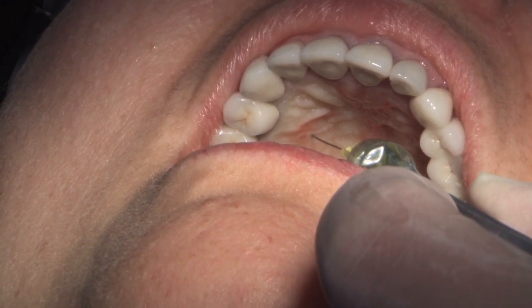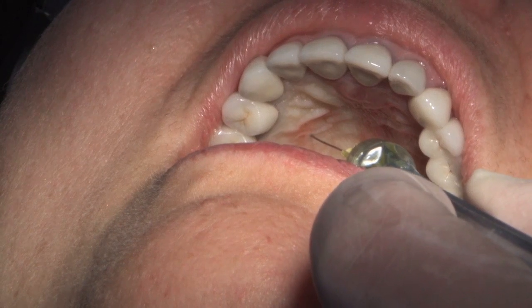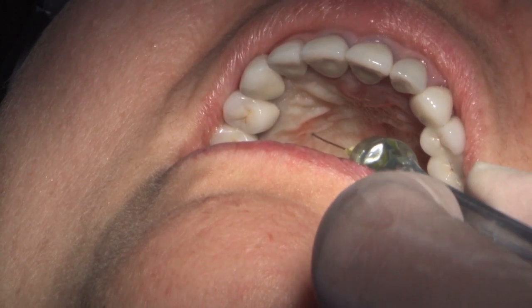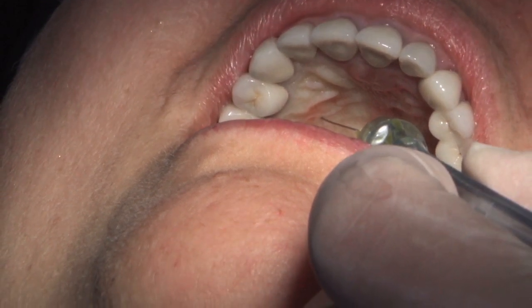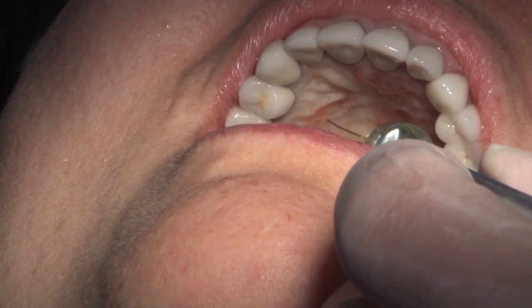Which, if I've got my terminology right, allows you to see your zenith line — wow, nice! That's a state board question. You're right — I can see it up to the second molar now.